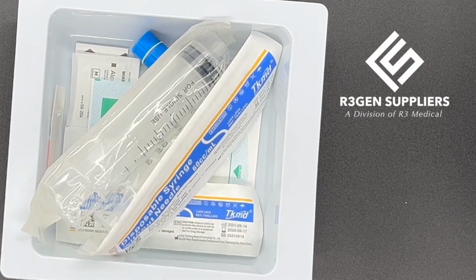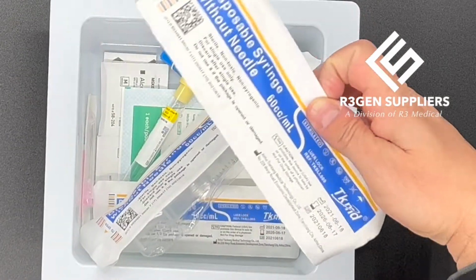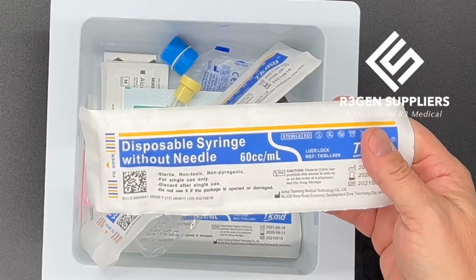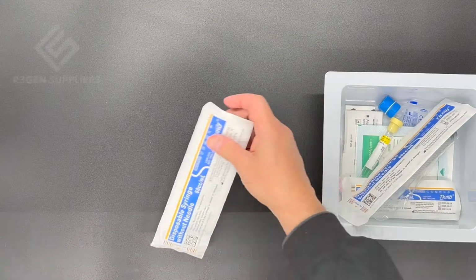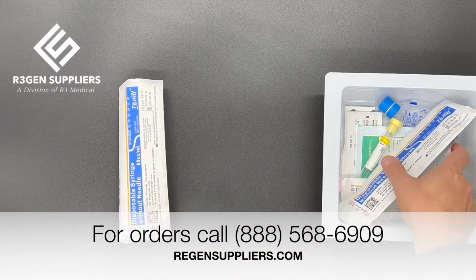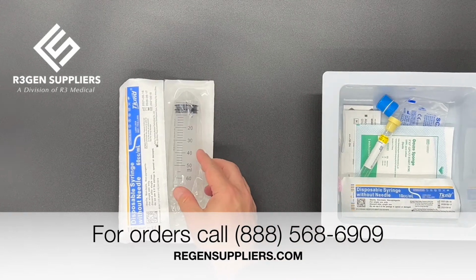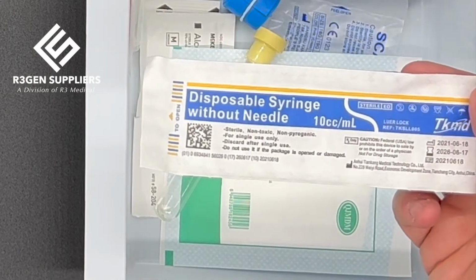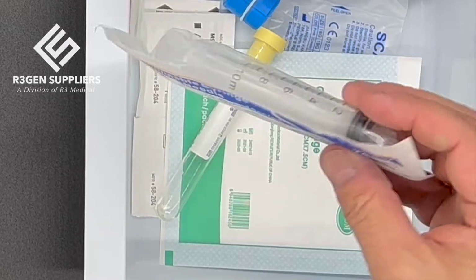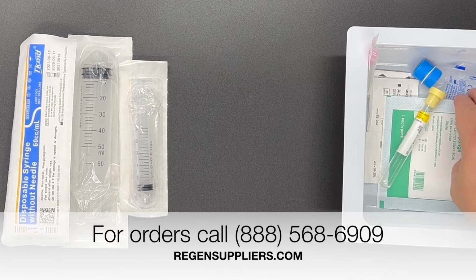All right. So one thing you'll see right off the bat is that there are two of these 60cc syringes. Pull this over a little bit. There's one. These are the same. Here's the second one. I'll put this one the other way. There's also a third syringe. It's a 10cc syringe as well.